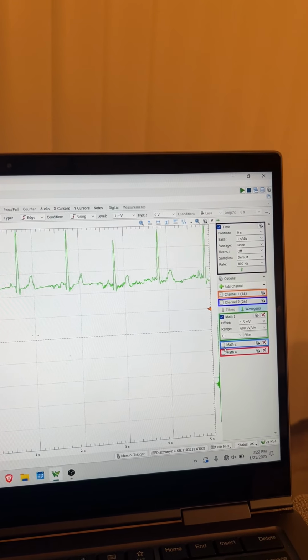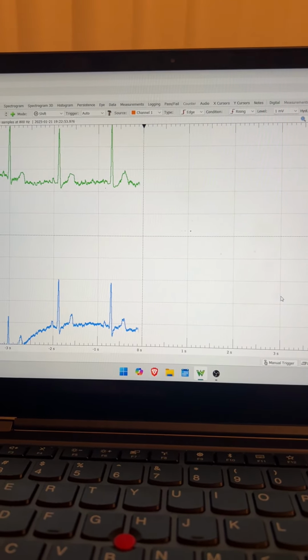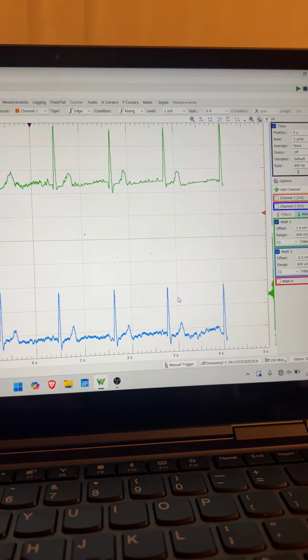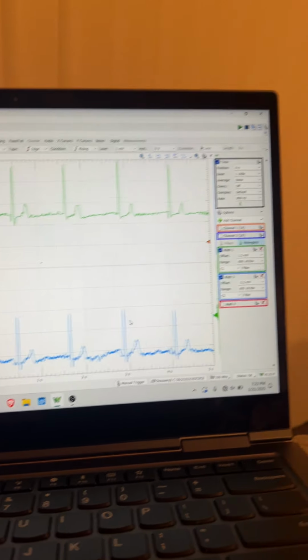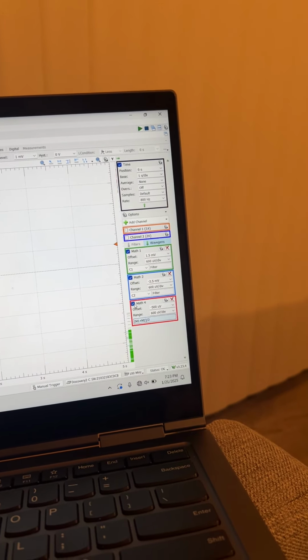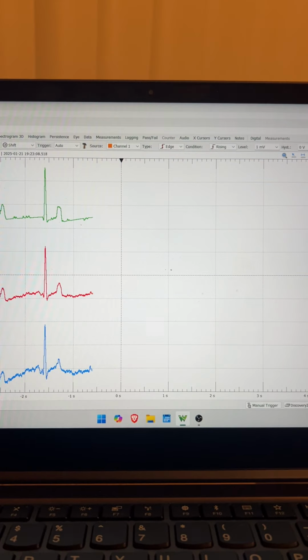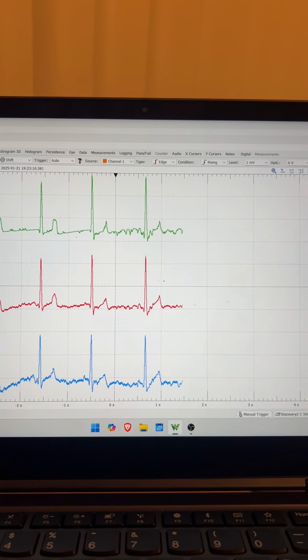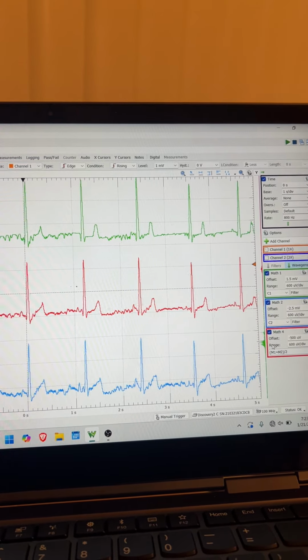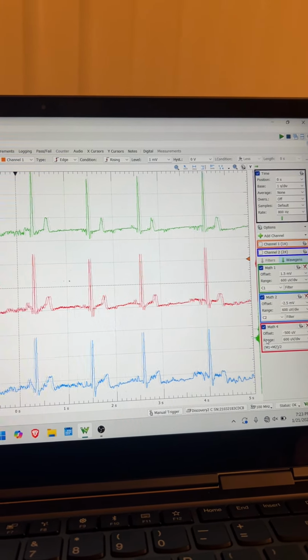Of course, we're doing that for both channels. And in doing so, we'll be able to see here the filtration acting on both channels. And of course, I mentioned the last part is basically just summing the data points from these two channels and literally just dividing it by 2, which I mentioned in the previous video. So there we go. That is how we are filtering this EKG data out.